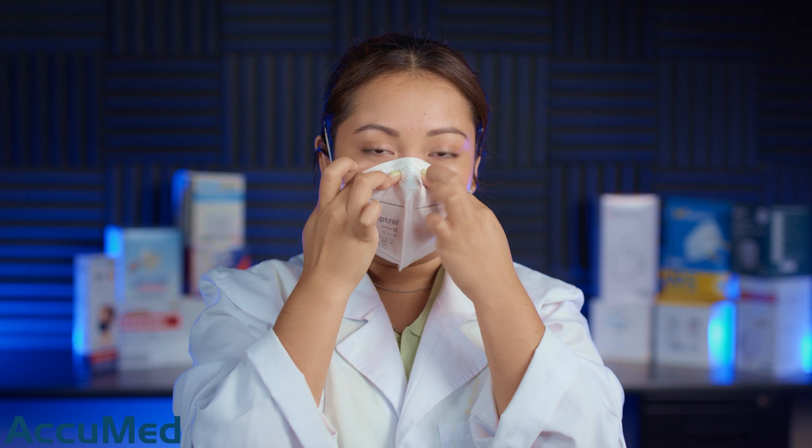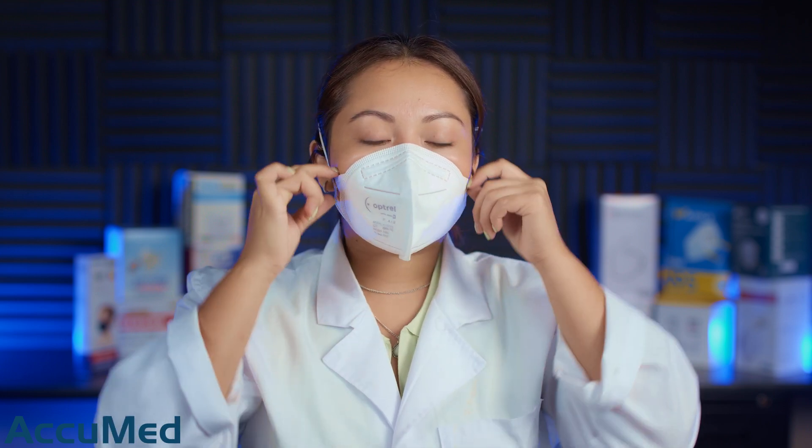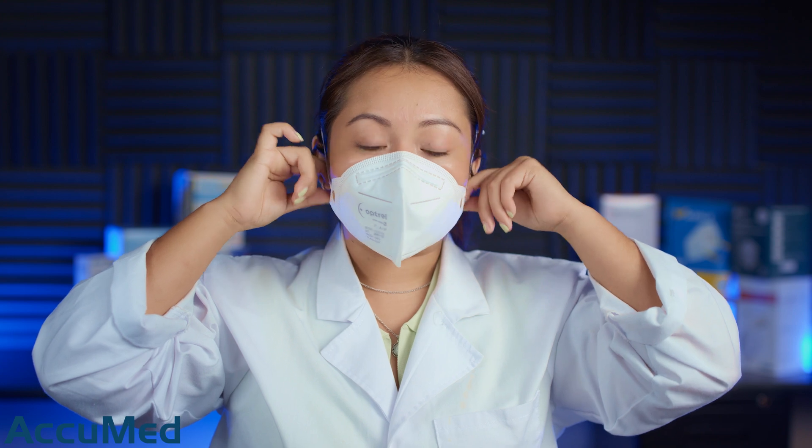So let's go ahead and try one of these on. Like I said, the nose wire is very stiff but it's also very hard to manage and frame it to your nose. The first thing I'm noticing is that it is a very itchy material for both the headband and the inside of the mask.